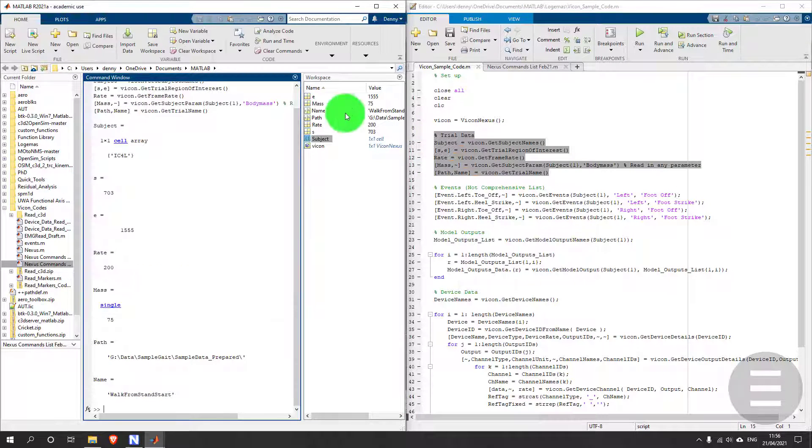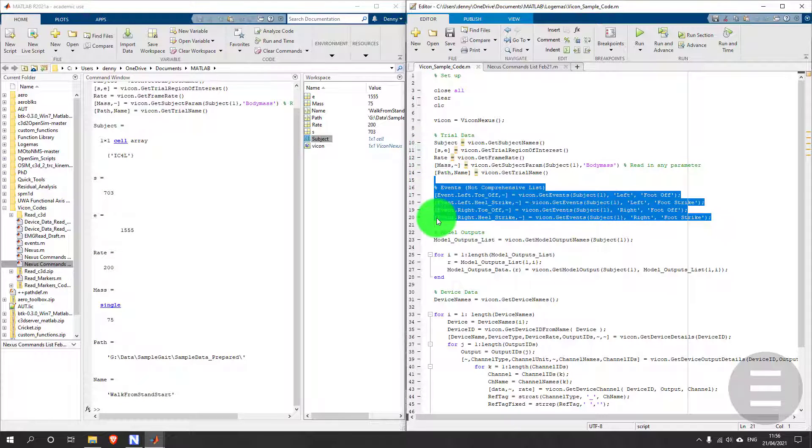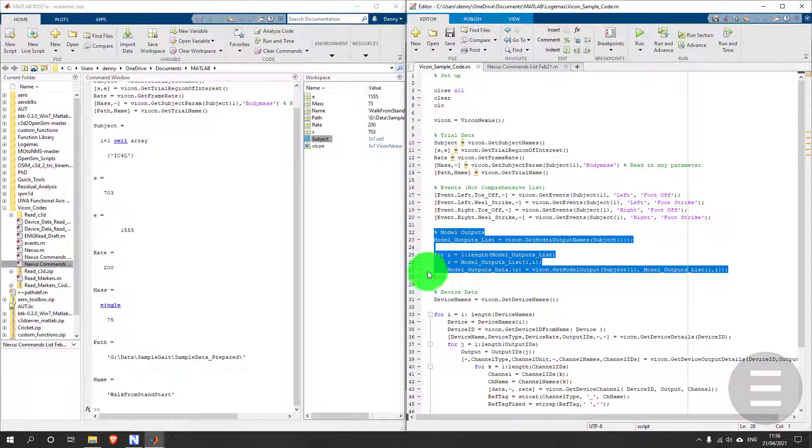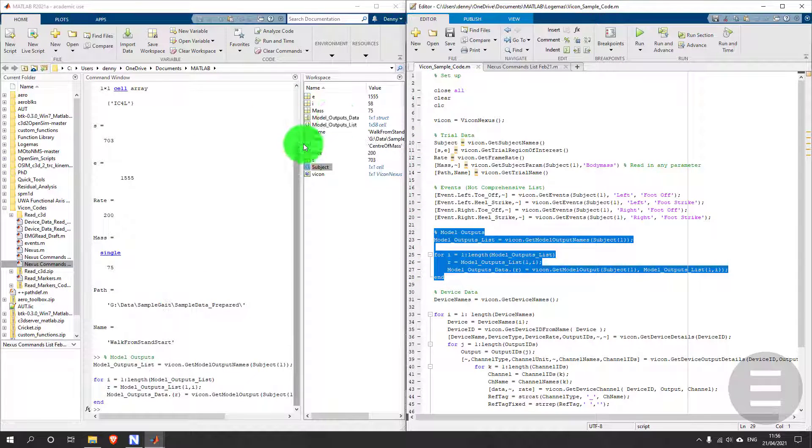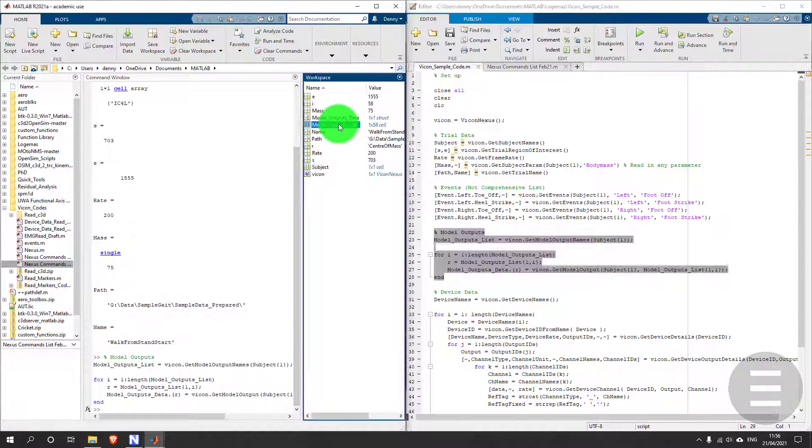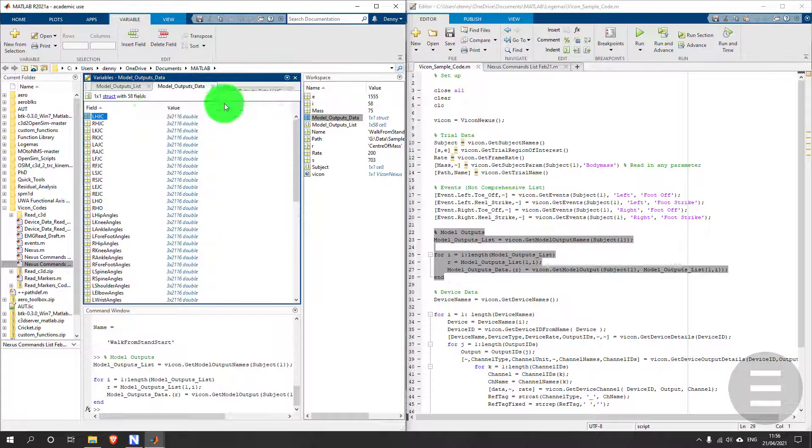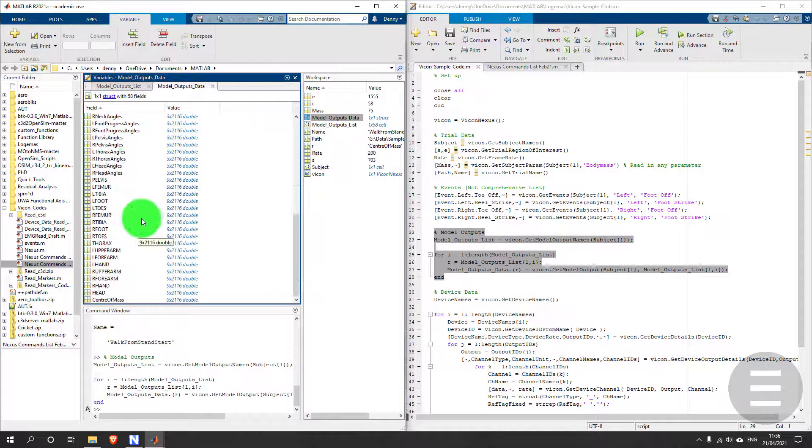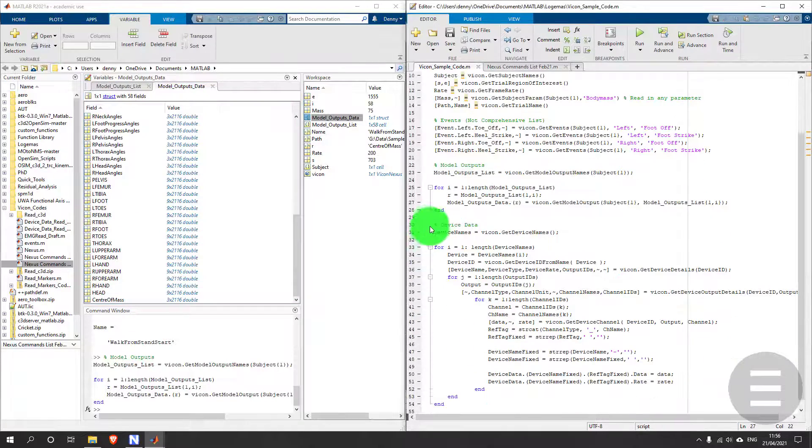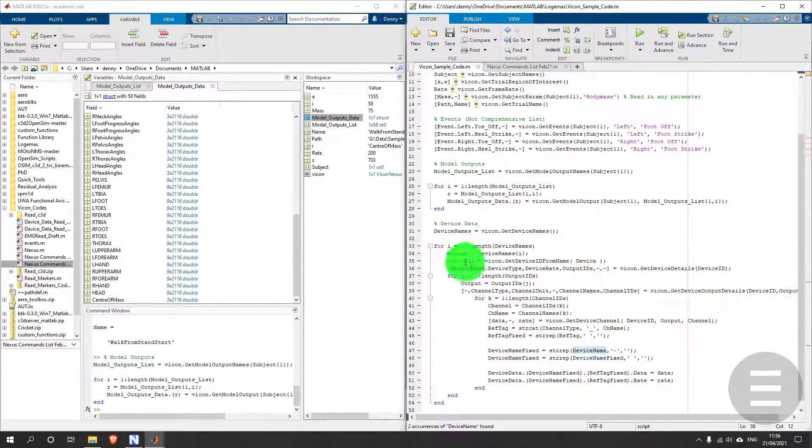Here's some basic parameters, then some event data. I don't have any event data in this trial so skipping over that. Model outputs including all my trajectories and any CGM outputs. That's a useful one. And device data, no devices in this trial so skipping that.